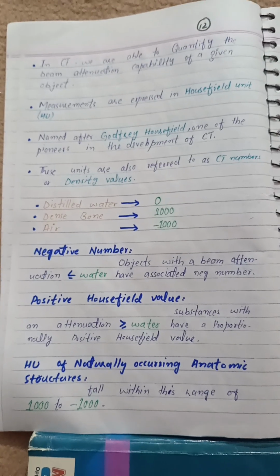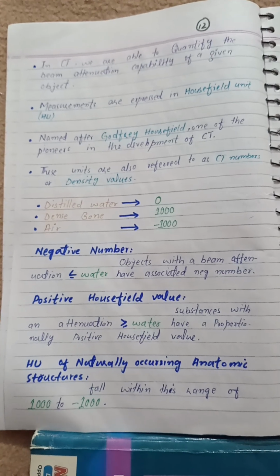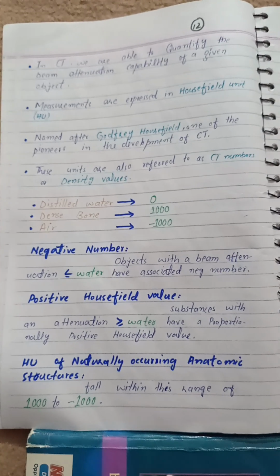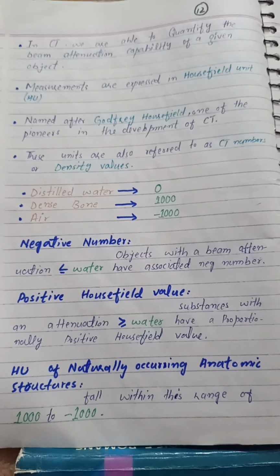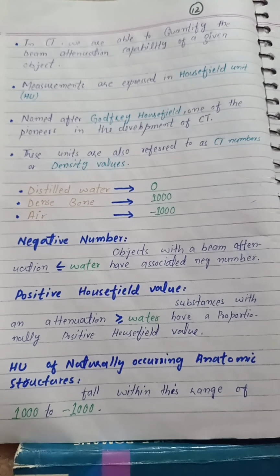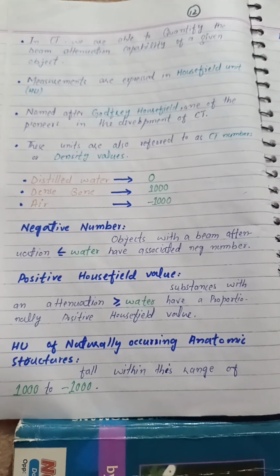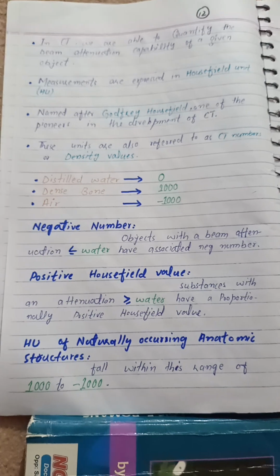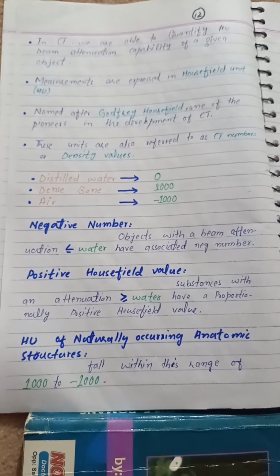In CT, we are able to quantify the beam attenuation capability of a given object. Measurements are expressed in Hounsfield units, named after Godfrey Hounsfield, one of the pioneers in the development of CT. These units are also referred to as CT numbers or density values. Distilled water 0, dense bone 1000, air minus 1000.